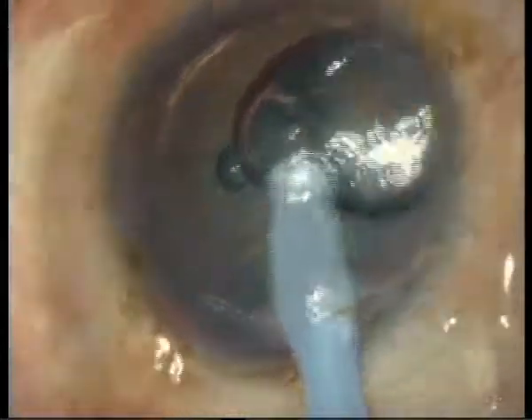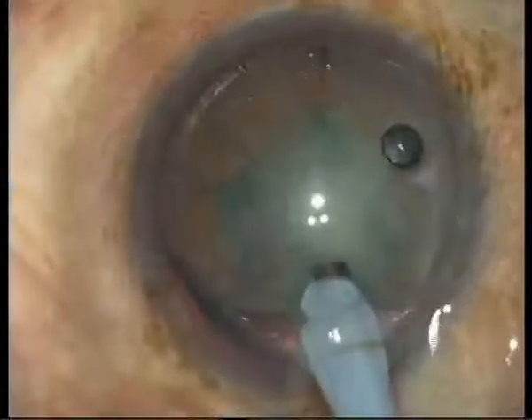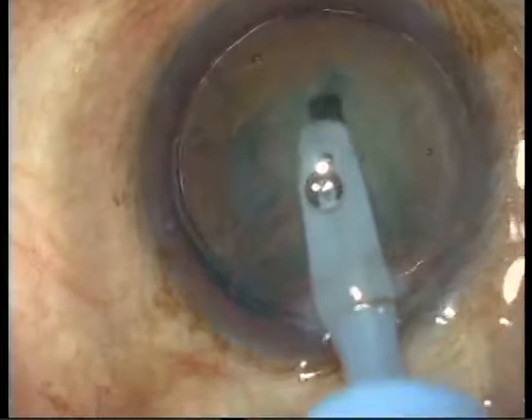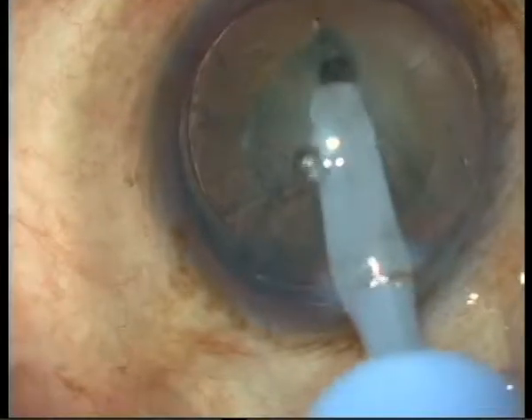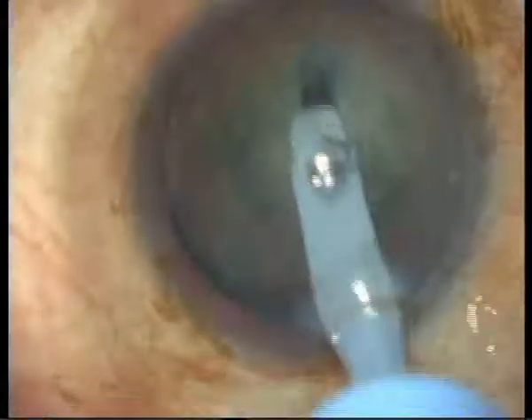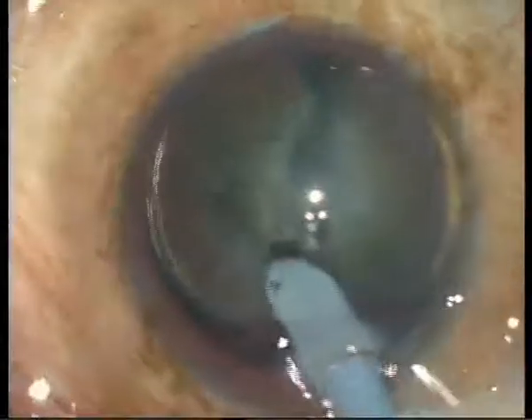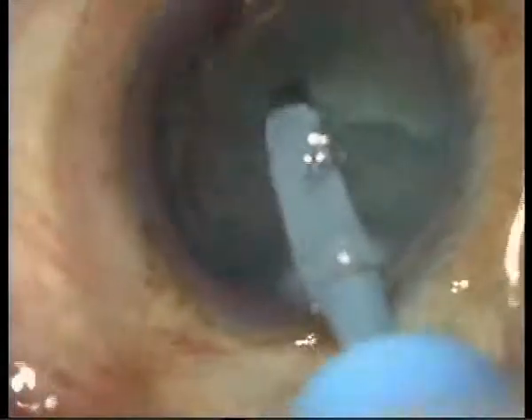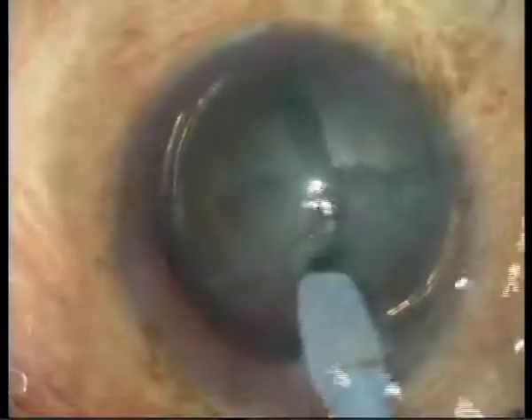The first step is sculpting. I do a mono manual phaco. For our standards, it's relatively high flow, and aspiration is a little bit high, but I know it now and I'm paying attention. I am very used to the divide and conquer technique.